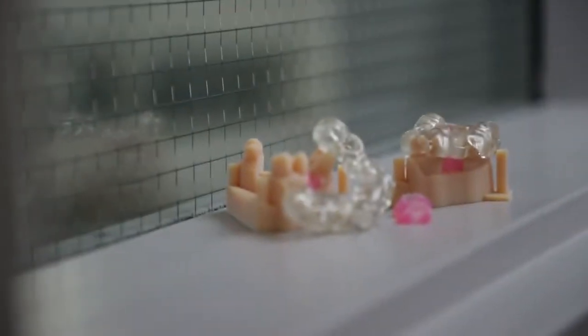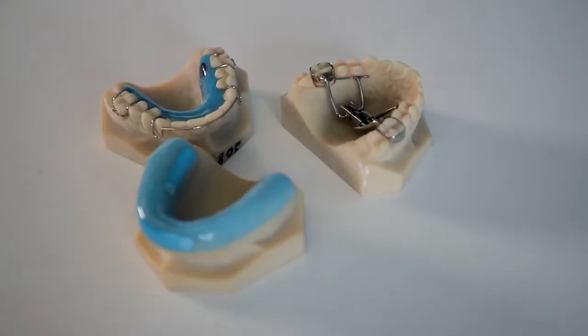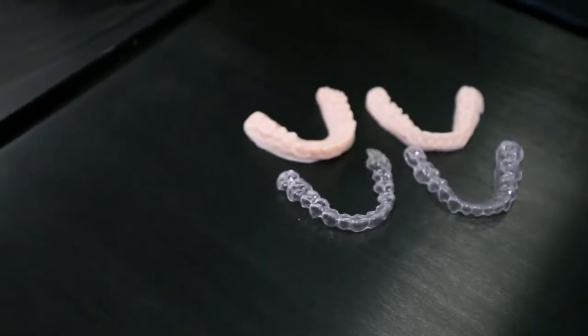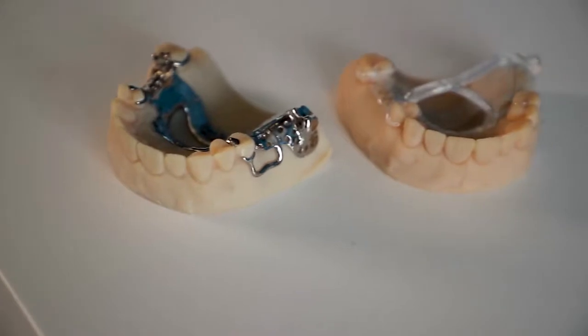It allows you to 3D print the widest range of applications all on one 3D printer, such as surgical guides and implant models with soft tissue, as well as maxillofacial models, ortho models for your appliances and clear liner arches, and of course crown and bridge models and partial castings.